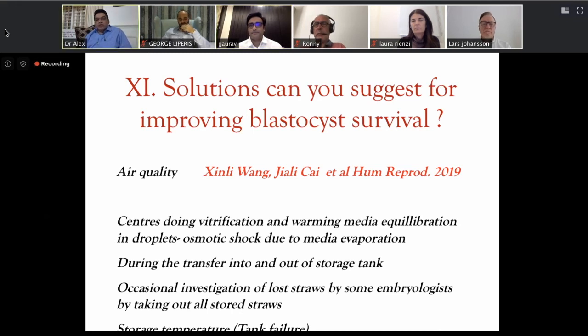When it comes to blastocyst freezing or vitrification, ideally you should have a KPI competency rate of 90%, or you can have a benchmark. You can keep it at maybe 99%. When it goes down, you have to look at the competency of the operator. That is one of the things, because we are seeing maybe those clinics who are adopting the vitrification had variable results in the earlier years. So that needs to be corrected. One has to follow the manufacturer's instructions.